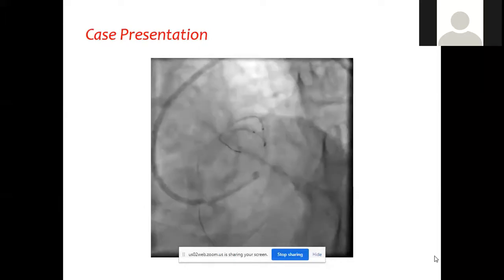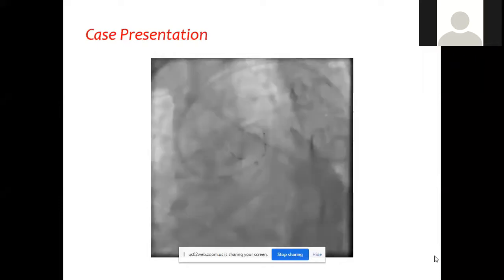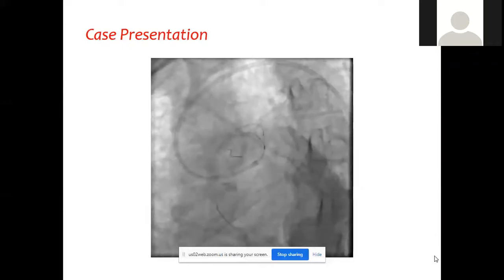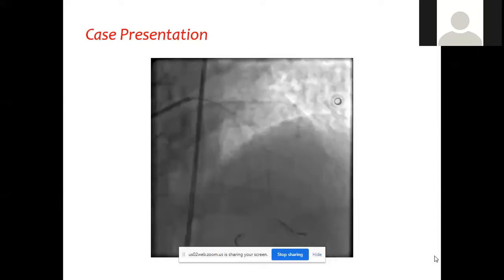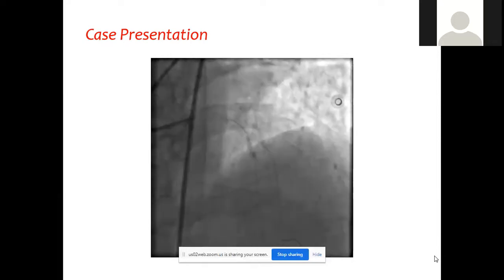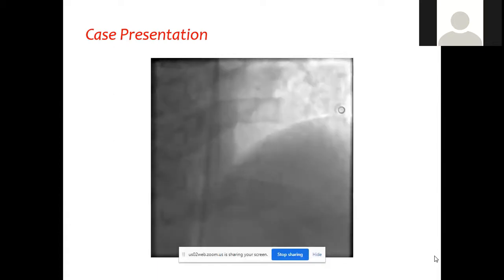This is very important here because we have to adjust with a non-compliant balloon the diameters of both vessels with a high pressure ballooning, as you can see here in the spider view. We park the other balloons in the guiding, 7 French guiding. Then, as you can see here, we attain flow within the 2 vessels. Unfortunately, we have to recross to the LAD again.